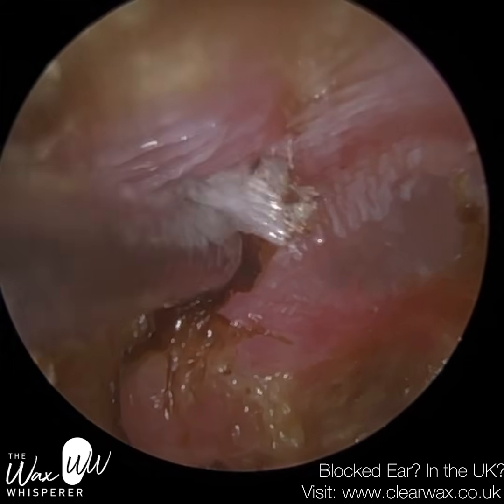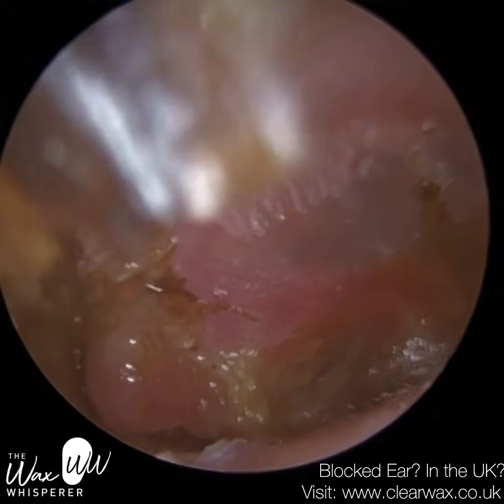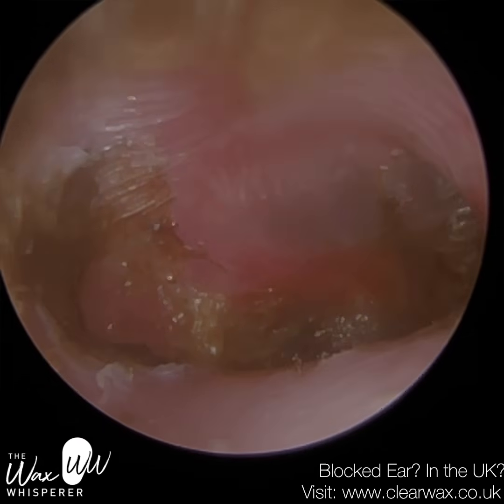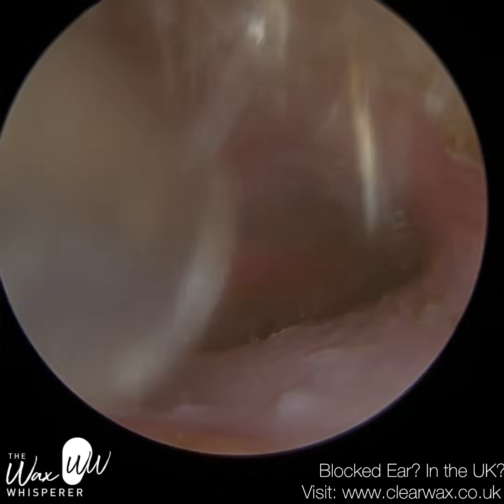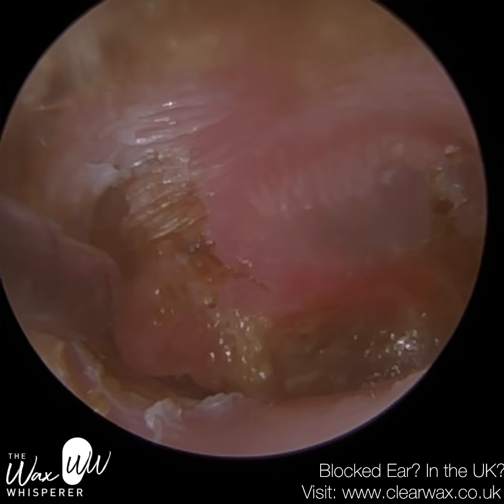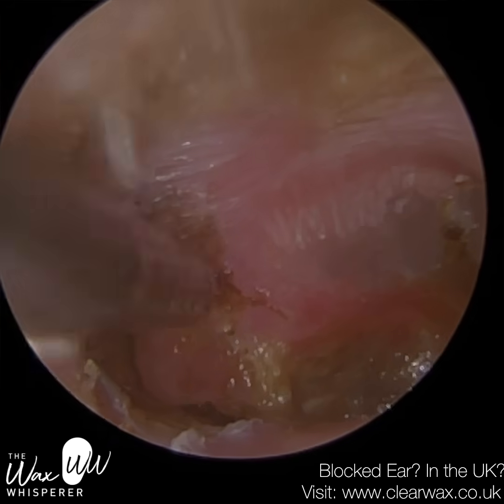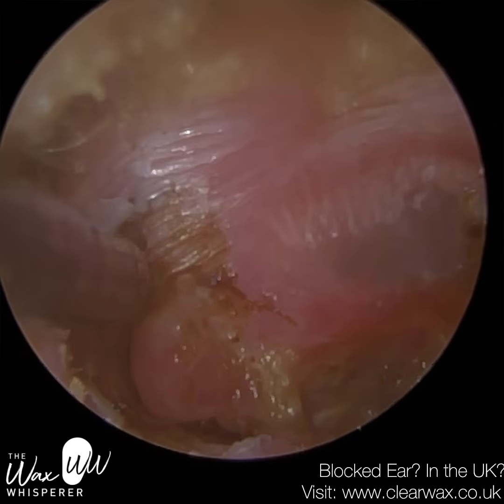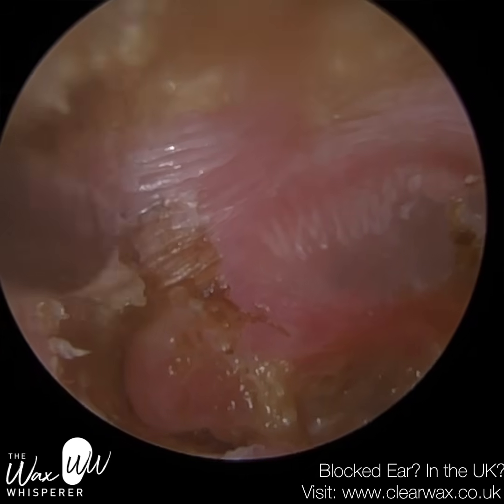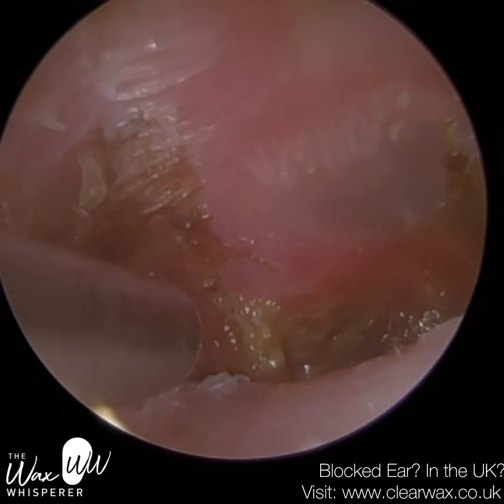So when you do a hearing test with someone with superior canal dehiscence, quite likely you're going to get a low frequency hearing loss via air conduction, because in the same way vibrations can enter the superior canal dehiscence, sounds can also escape. So when we put headphones into this patient's ear and did a hearing test, the sound enters the ear, hits the eardrum, vibrates, and typically the vibrations are transmitted through the three little bones in the middle ear called the ossicles to the organ of hearing, and the stapes bone in particular, which is the smallest bone in the body.